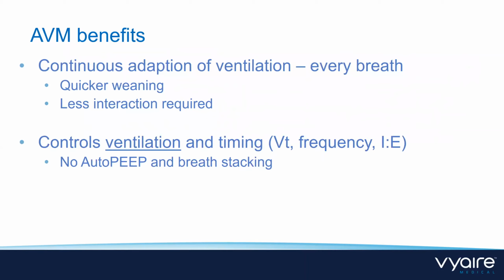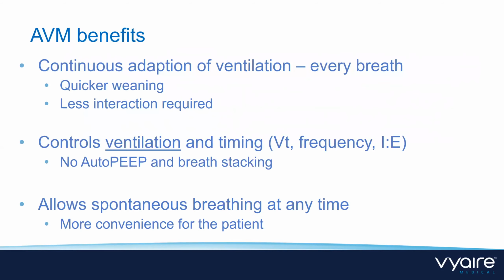It also controls the ventilation and the timing. So there are measures in place that no auto PEEP can develop, and also no breath stacking. And last but not least, AVM allows spontaneous breathing at any time.